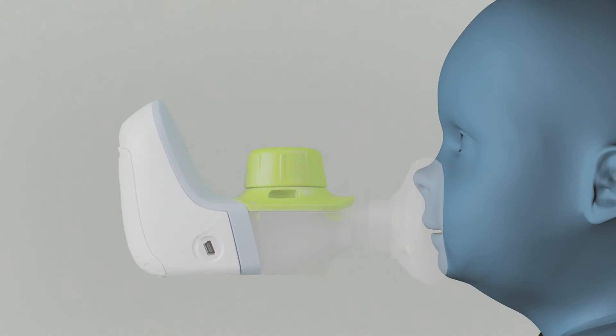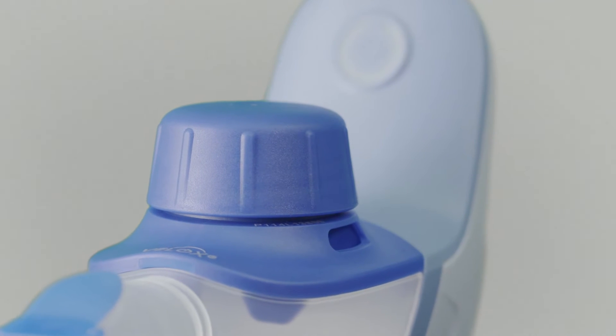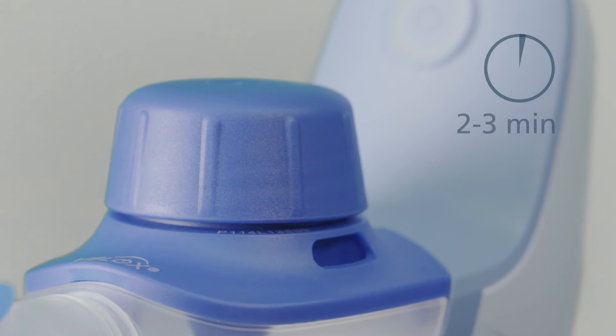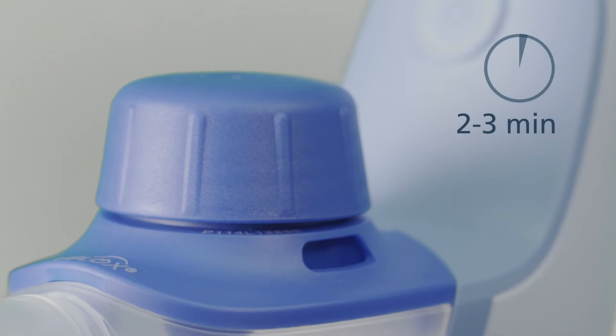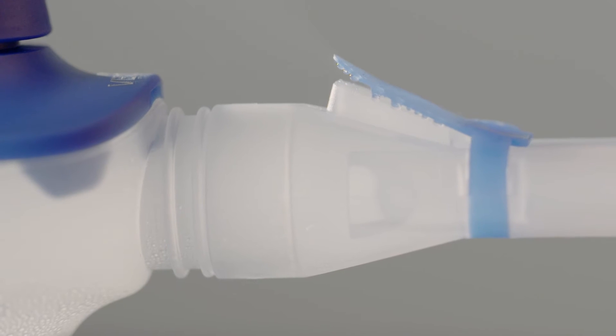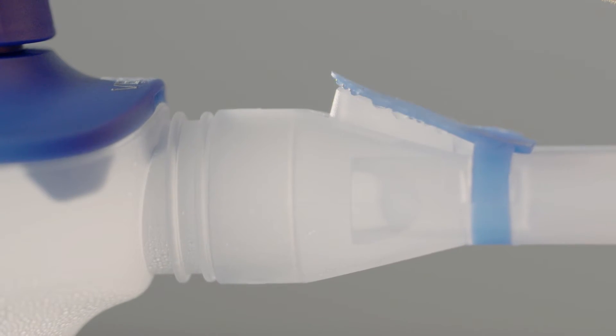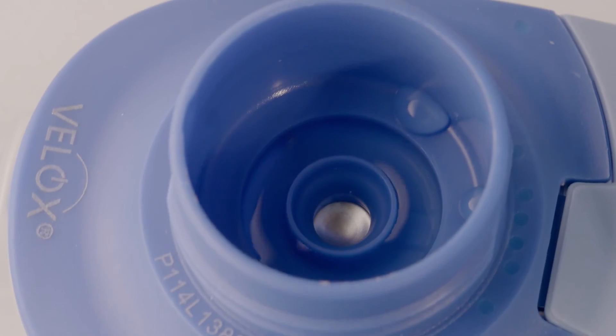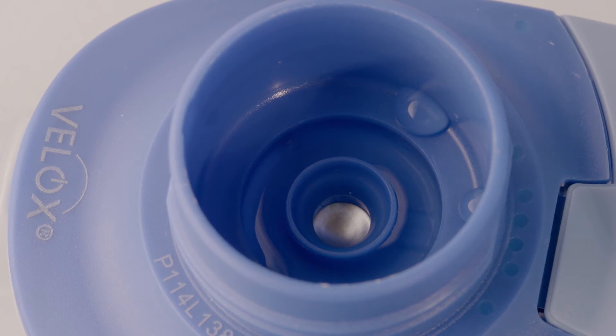If a small child is inhaling with Velox Junior, please ensure that the mask sits snugly on their face. It generally takes around 2 to 3 minutes to inhale 2.5 milliliters. The session is finished when no more aerosol comes out of the expiratory valve on the mouthpiece. The correct amount of medication is inhaled with the device. It is normal that some of the solution is left over.